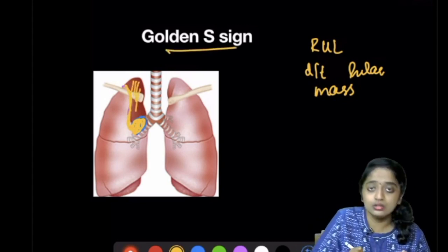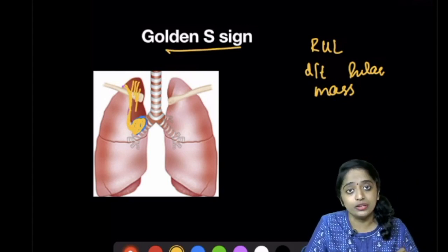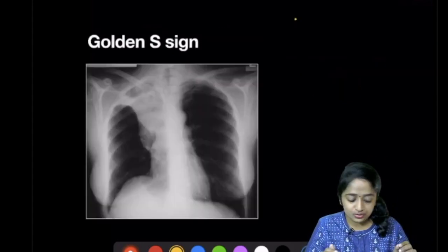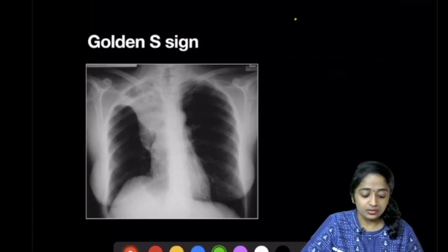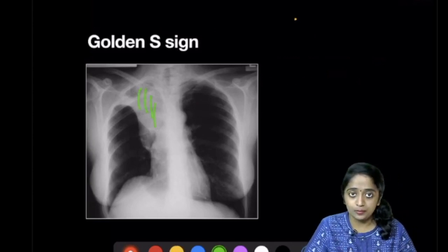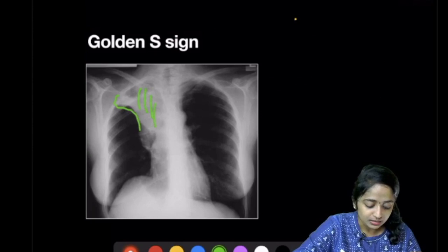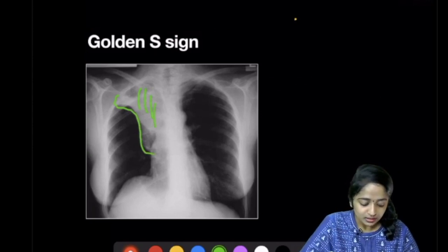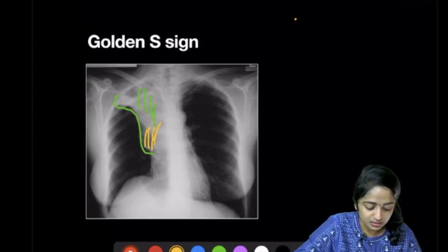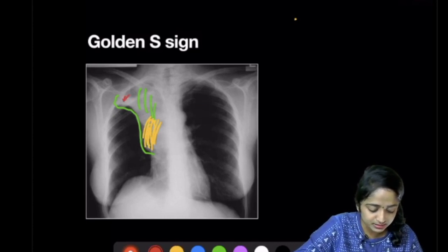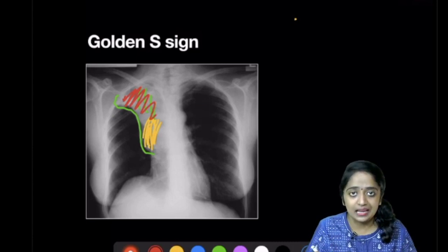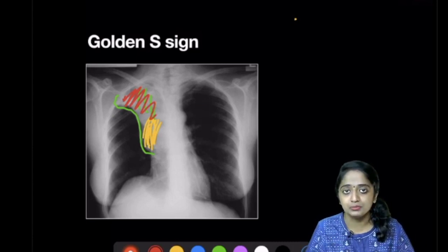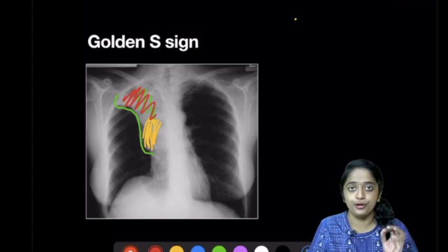On this radiograph, you can see loss of aeration and volume loss in an S-shaped manner — this part representing the hilar malignancy and this part representing the collapsed lung. This is the Golden S sign of right upper lobe collapse due to a hilar mass.